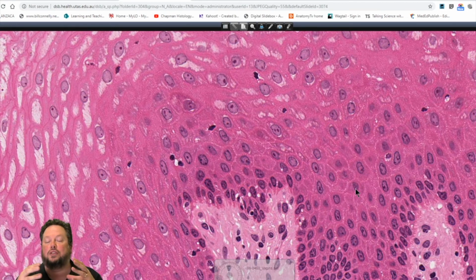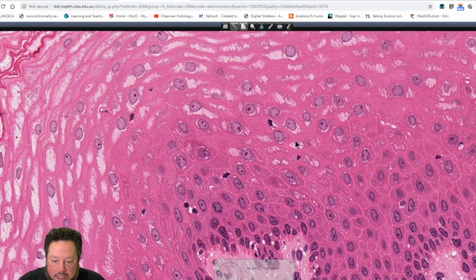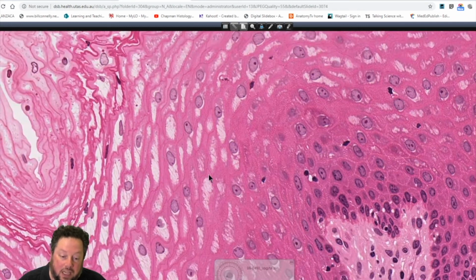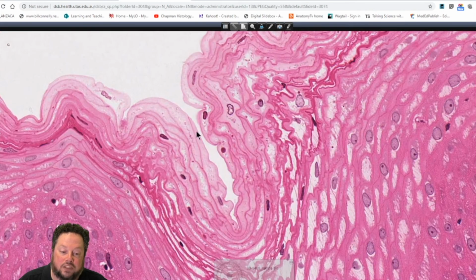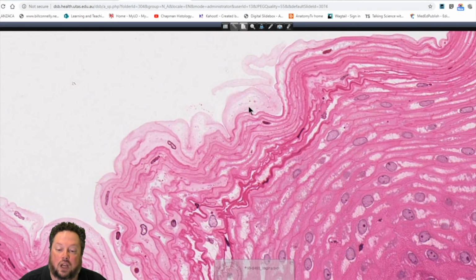And of course, those desmosomes are there to hold the cells together because the vagina has a potential for abrasion. As these cells migrate, can you see these very pale regions around the nucleus, for example? These are accumulations of the glycogen, and the glycogen doesn't stain with hematoxylin and eosin. Then as these cells migrate closer to the surface, they become more and more squamous. The nuclei become a bit more flattened, and we see an increase in glycogen within the cytoplasm, such that the surface cells are flattened cells with very little evidence of cytoplasmic stain.